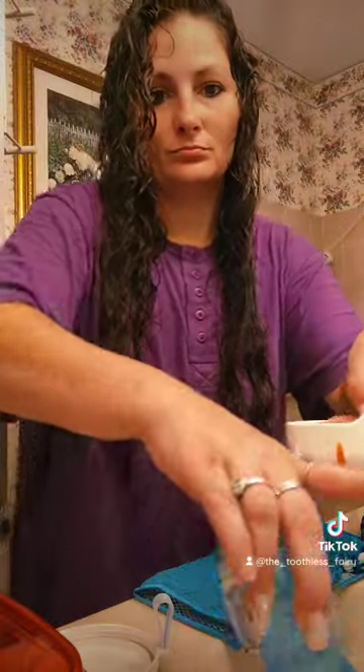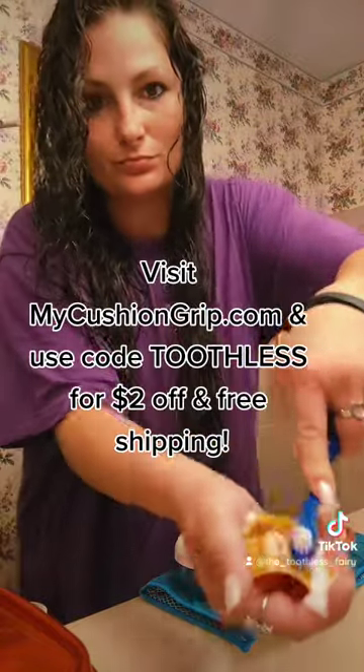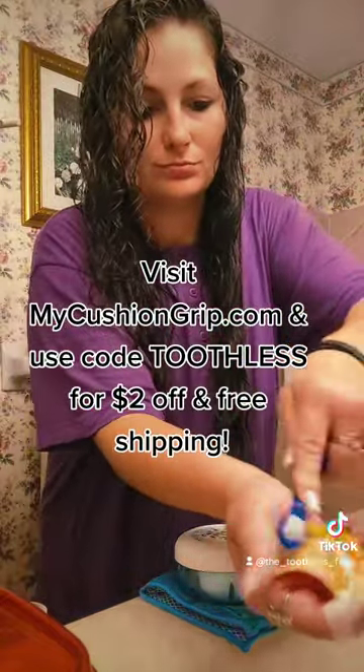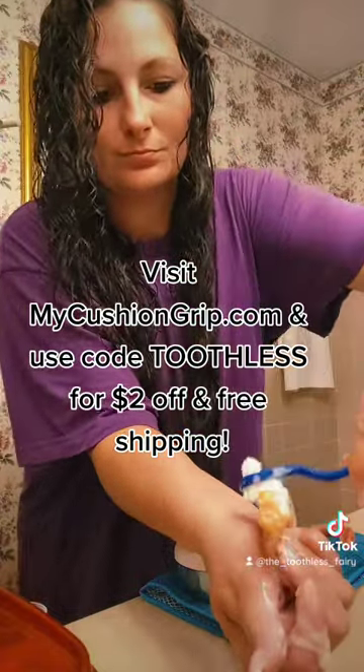Cleaned these gums with Dr. B's cleansing gel. They've soaked for three minutes, I'll pour it out, and commence to brushing them. People always ask me, how do you clean your dentures with cushion grip on them? Just like this. It's no different than you normally would. You just scrub, brush, soak, all that.